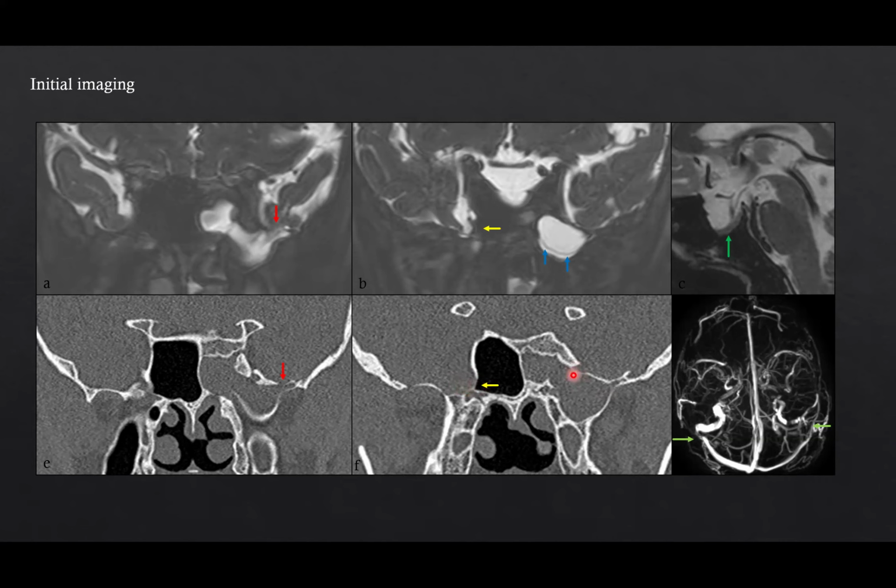You have an encephalocele with fluid within the lateral recess of the sphenoid sinus, which is causing CSF rhinorrhea. And he has all features to suggest intracranial hypertension. So probably it's an intracranial hypertension which has led to these encephaloceles and then to the CSF rhinorrhea.